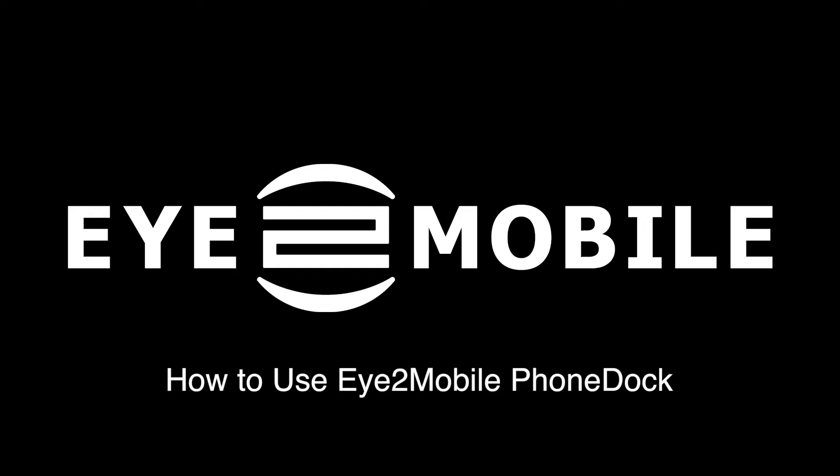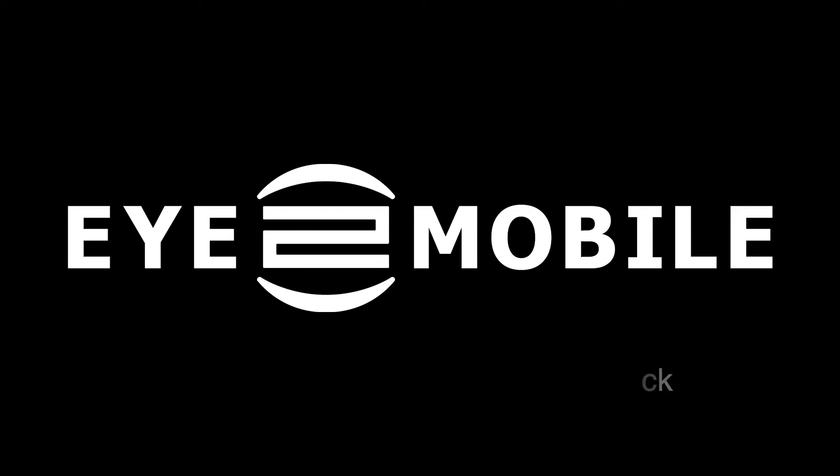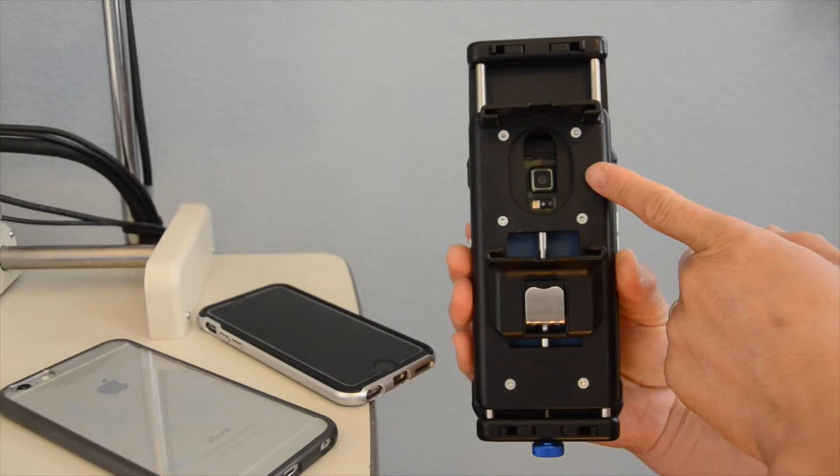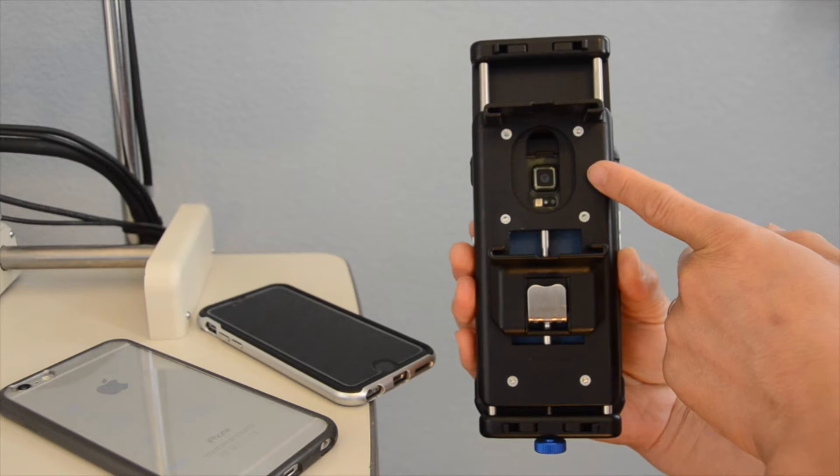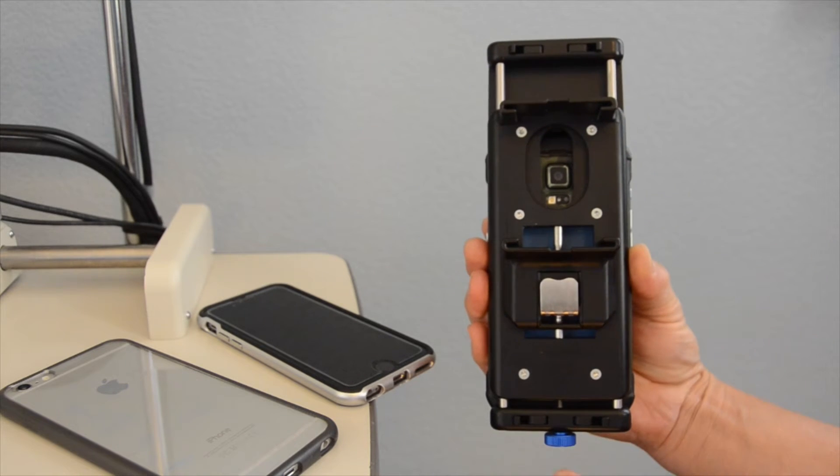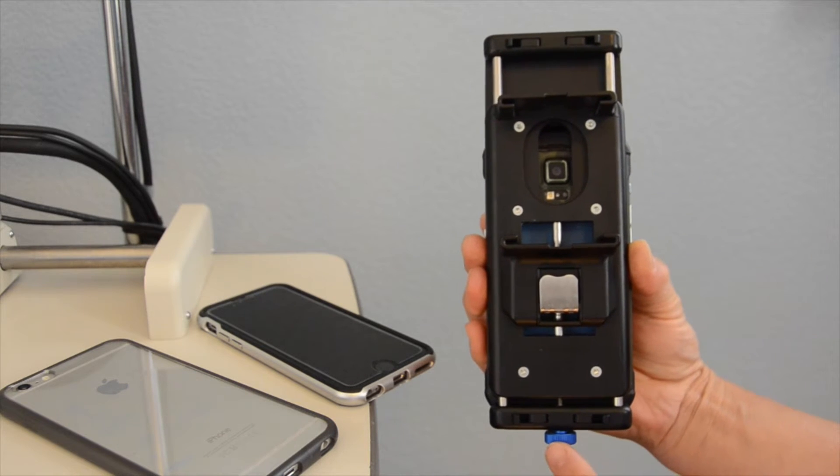This is an introductory video on how to use i2 Mobile's Phone Dock. Prior to using the Phone Dock, you'll want to pre-configure it to better work with your phone.